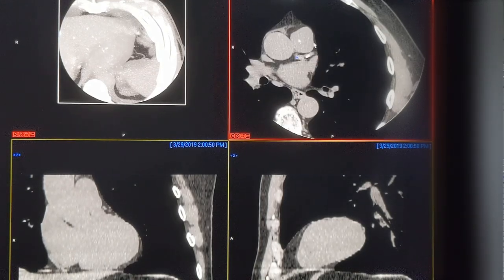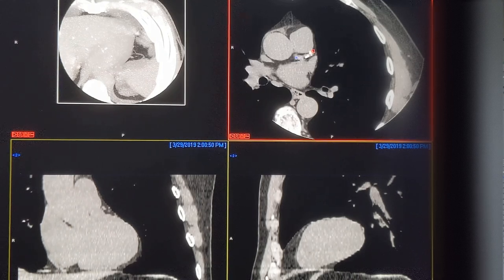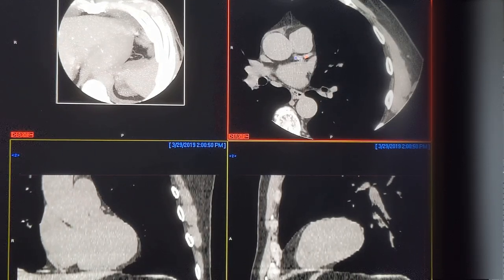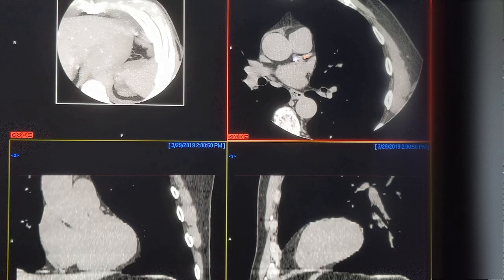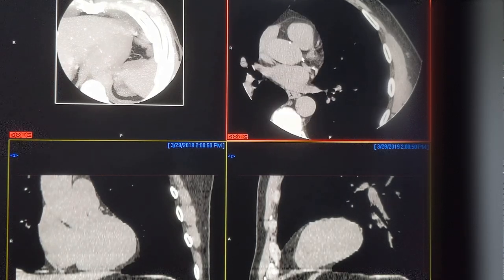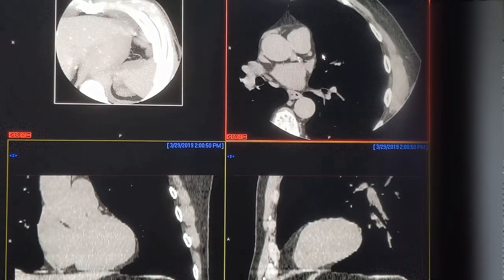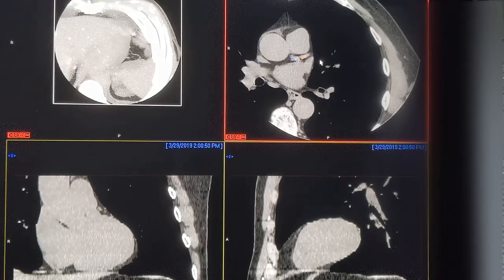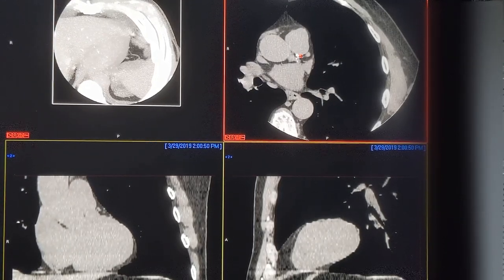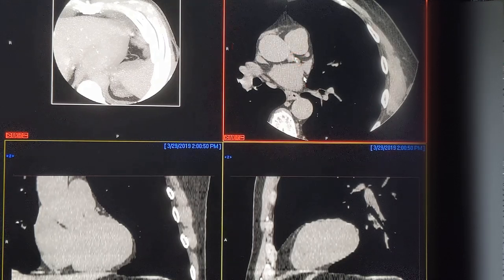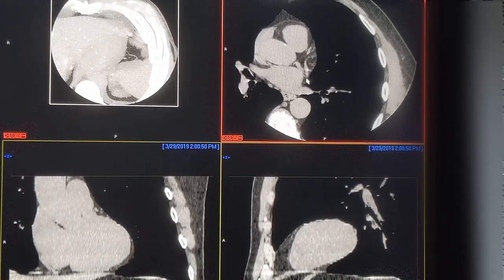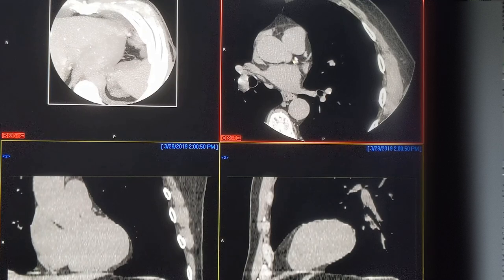The key point is that the radiologist must identify the appropriate coronary anatomy, and then you can select the algorithm to score the vessel. As you can see, that changed to red because I selected the LAD for scoring. Now we're going to get into the circumflex, which is yellow — probably going to be a little difficult to see — but as you can see here, I'm just selecting those vessels.